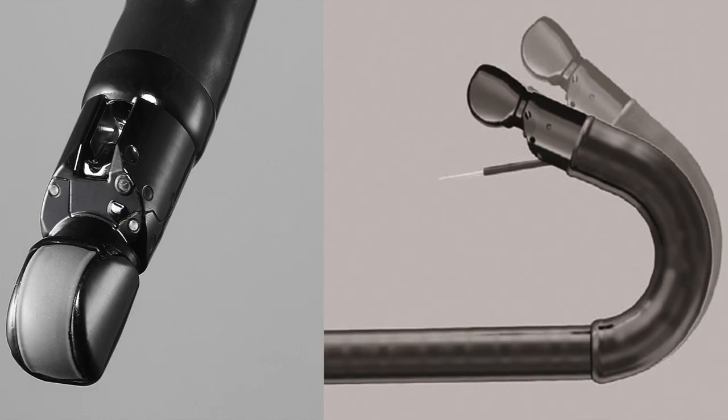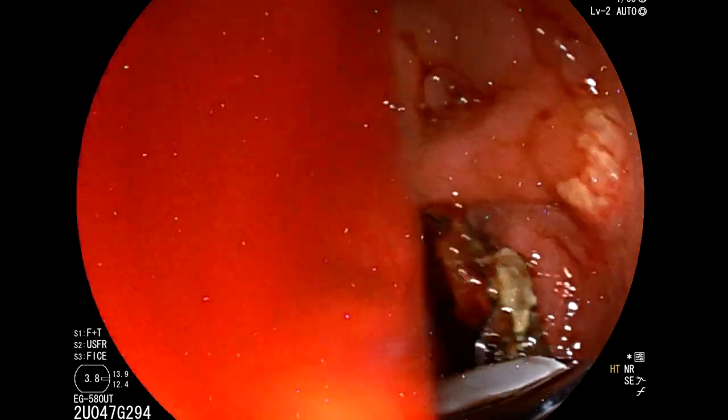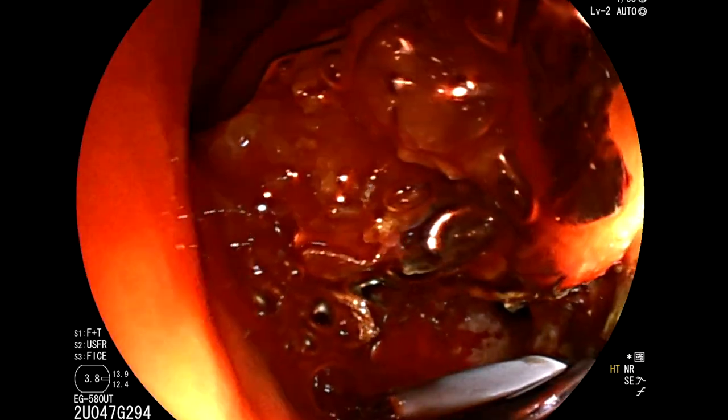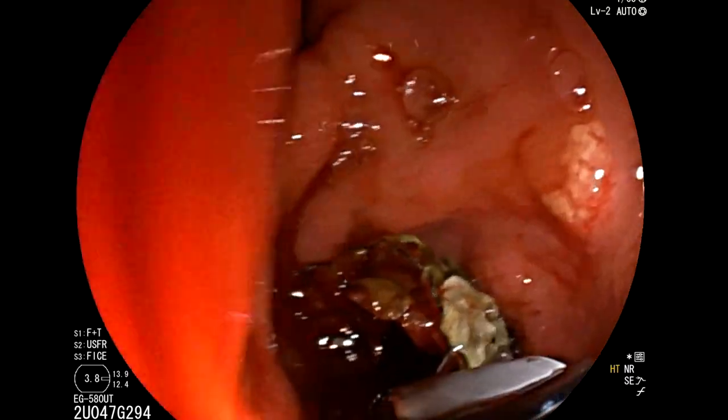The Fujifilm EG580UT therapeutic echoendoscope is uniquely suited for therapeutic interventions, particularly biliary drainage. The distal diameter is thin and measures only 13.9mm, as compared to other therapeutic echoendoscopes that are 14.3 to 14.6mm. Also, given that the field of view is 140 degrees as compared to 100 to 120 degrees with other therapeutic echoendoscopes, it is ideal for navigation, providing ease of ability in viewing the advancement path.